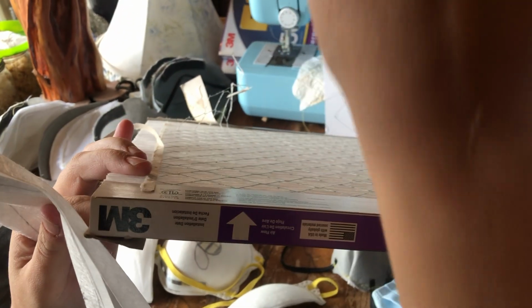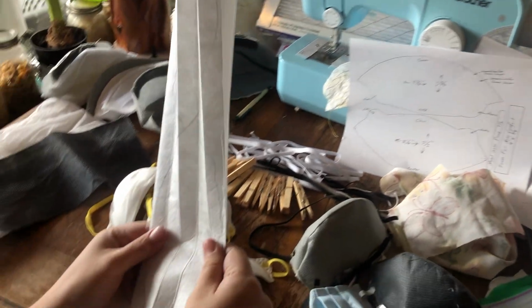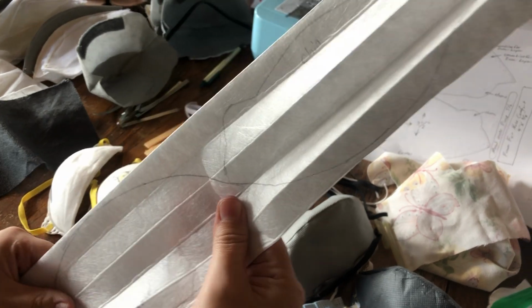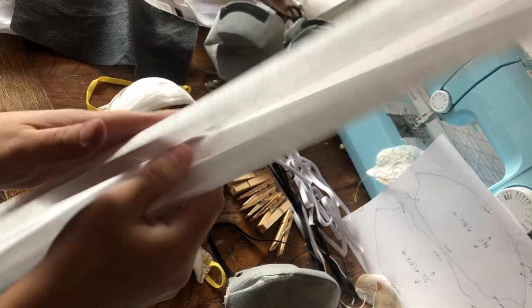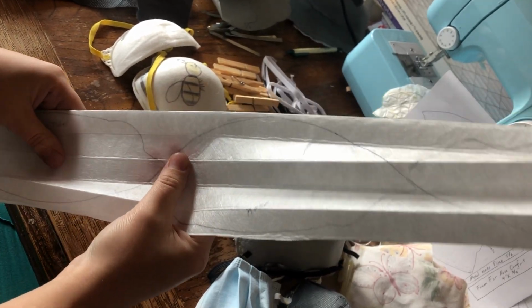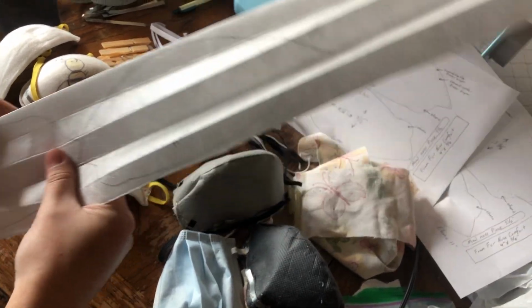So the air is supposed to go a certain way. What I decided to do, and I don't know if this is the best plan or not, is to make the airflow trap the particles in the middle, hopefully. I have the air flow going one direction on one layer and the other direction on the other layer. So I am trying to trap the stuff that would go out of your mouth and the stuff that would come into your mouth. Like I said, I don't know if that's actually going to do any good or not. It's just my idea.